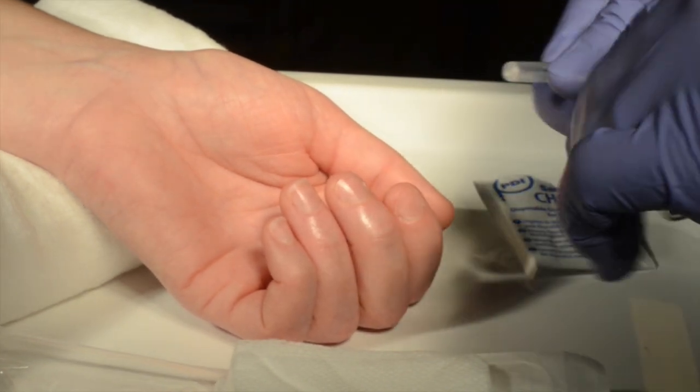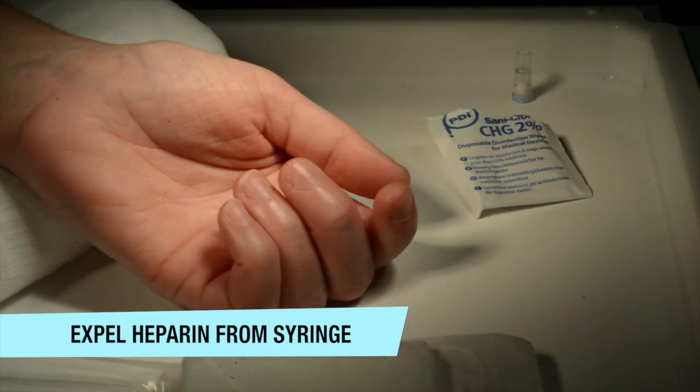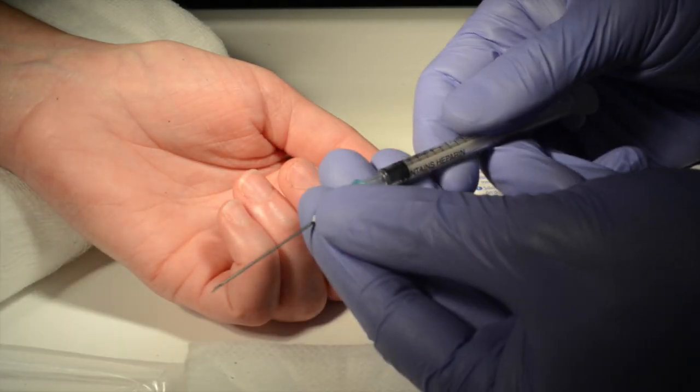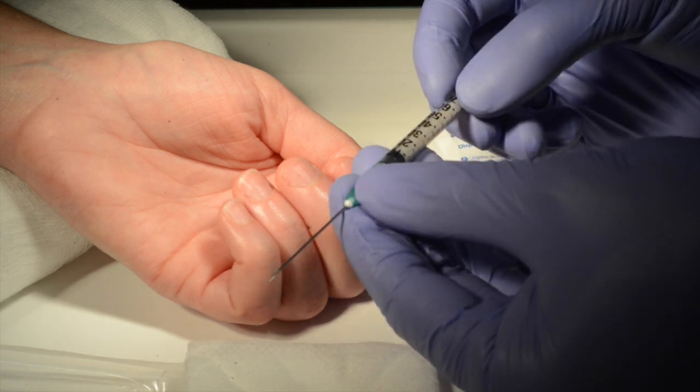To prepare the ABG syringe before use, make sure you expel the excess heparin from the syringe. Then fix the 21 gauge needle to the end of the syringe.